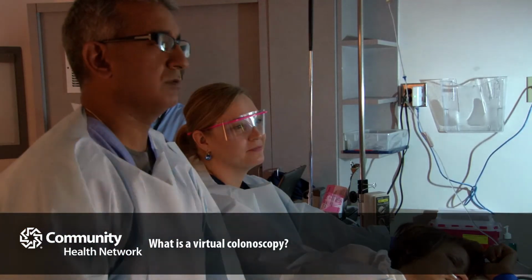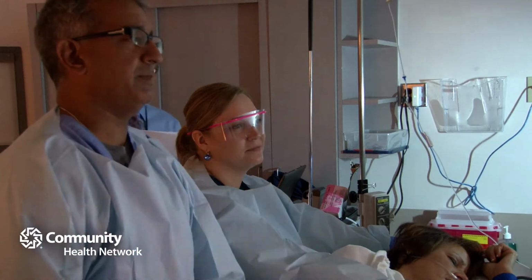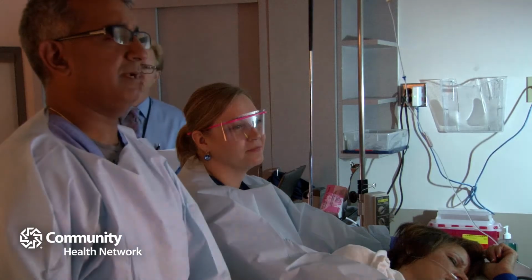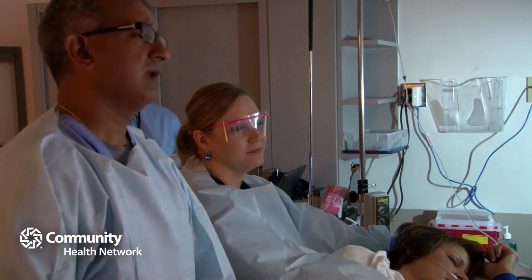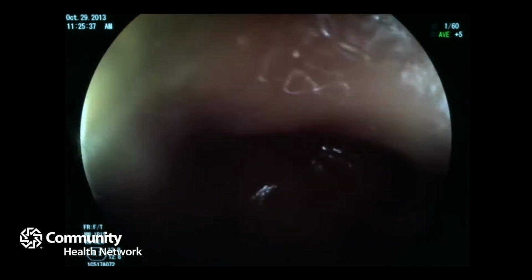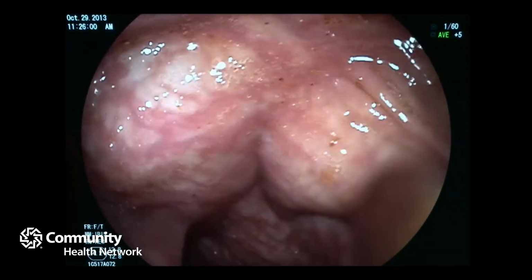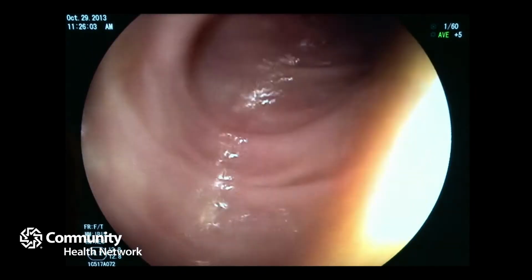Question that we got though was, it looks like from an informed viewer, what is a virtual colonoscopy? So a virtual colonoscopy or a CT colonography are basically the same now. So basically what you do is you still have to prep, and there's a specialized CAT scan and they inject air through your colon and take pictures. It is a very useful test for us in two ways. We use it either if we cannot get through the colon based on anatomy or risk, scar tissue, you feel like you're going to cause a problem, or in someone very high risk where you do not want to sedate them or you think the risk of a colonoscopy is not outweighed by the benefit. So there I use them.